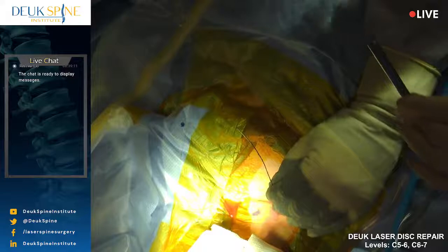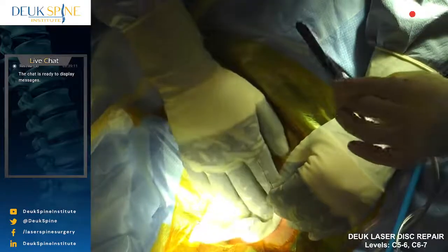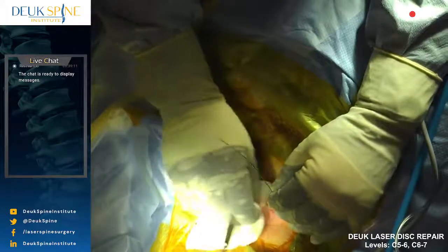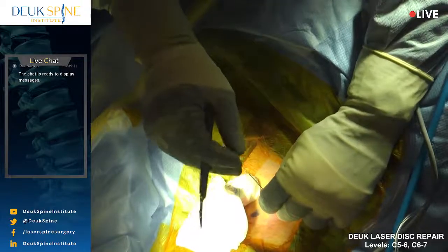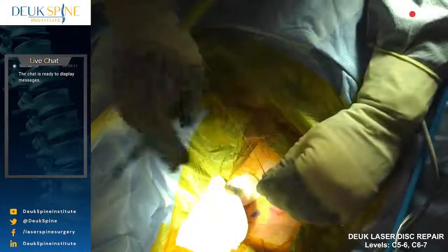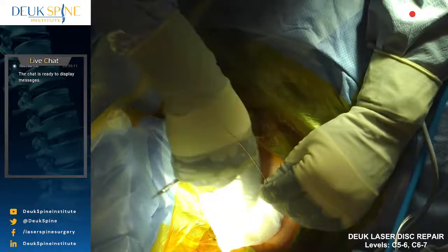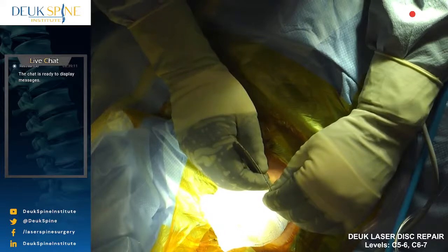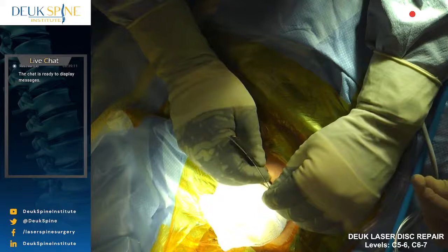Spine surgery can be broken up into different types of surgery. There's tumor surgery, there's trauma, there's infection, but which is rare, by the way. Infection and tumors are pretty rare. They're not that common. I'm making an incision 4mm in the skin in the front of the neck.